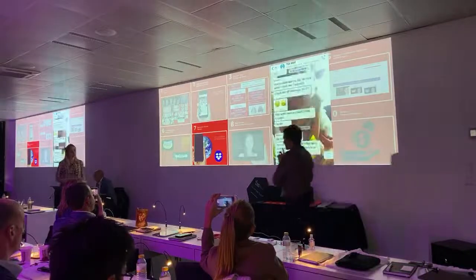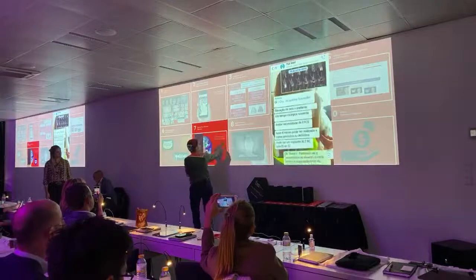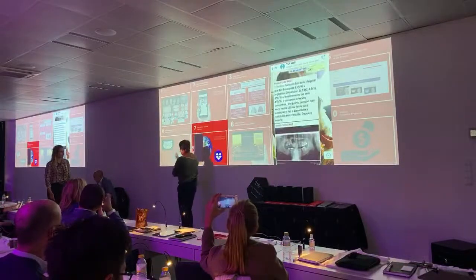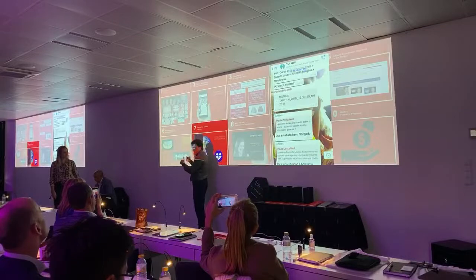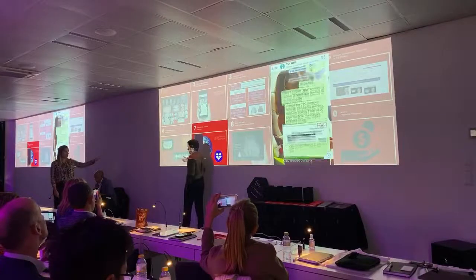So step number 7 is actually a big step because you already downloaded the presentation, right? You already sent the project because Smile Design is approved. Treatment plan is not approved. So to speed up the process, you already asked the lab to manufacture. Yes, this won't change.